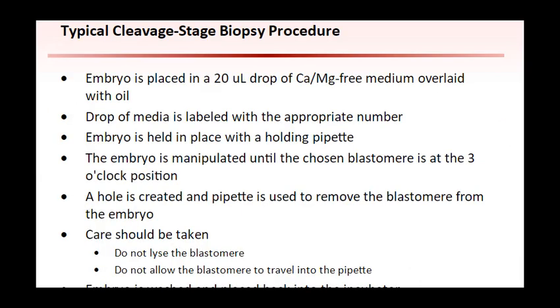Cleavage-stage biopsy consists of multiple steps. First, the embryo is placed in small drops of calcium and magnesium-free medium overlaid with oil. This medium assists in the breakdown of gap junctions between blastomeres and facilitates easier removal of the blastomeres from the embryo.